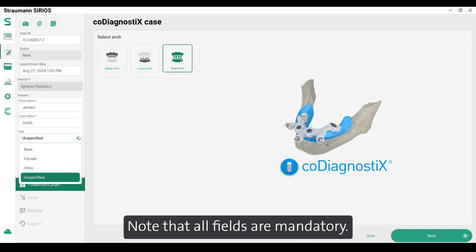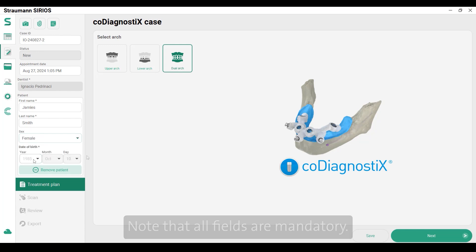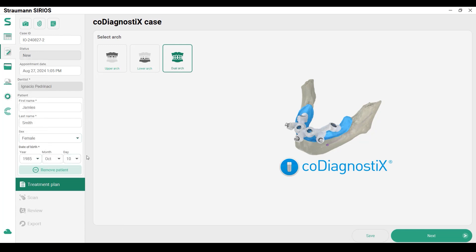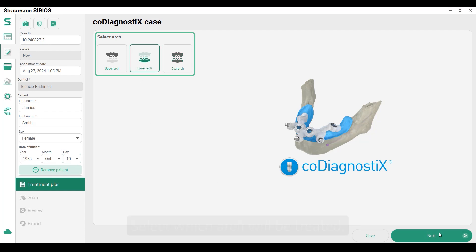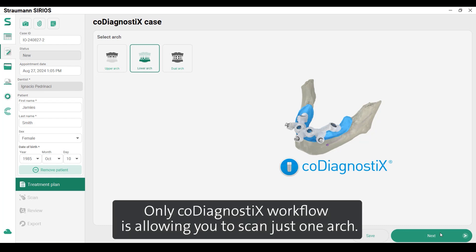Note that all fields are mandatory. Select which arch will be treated. Only the co-diagnostics workflow allows you to scan just one arch.